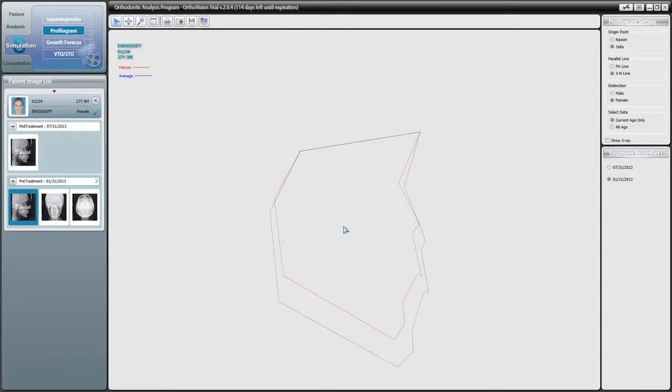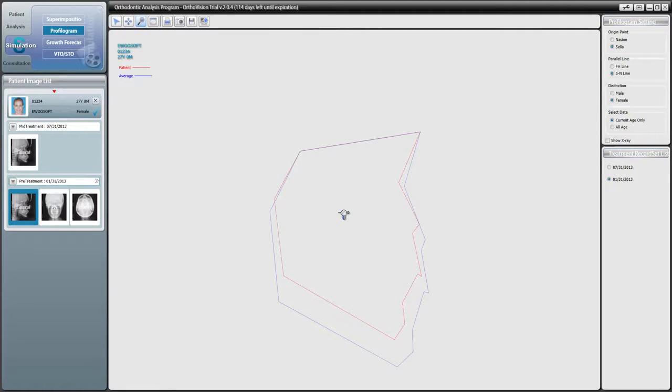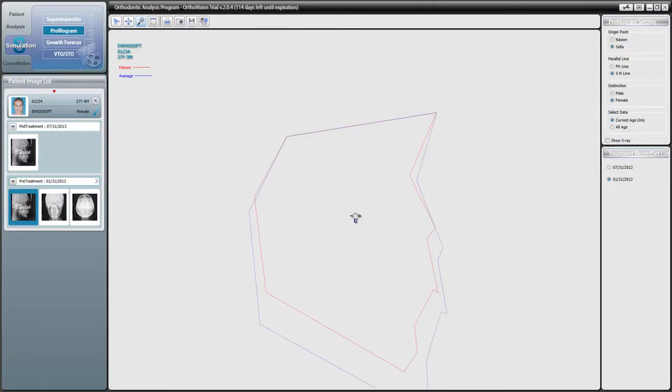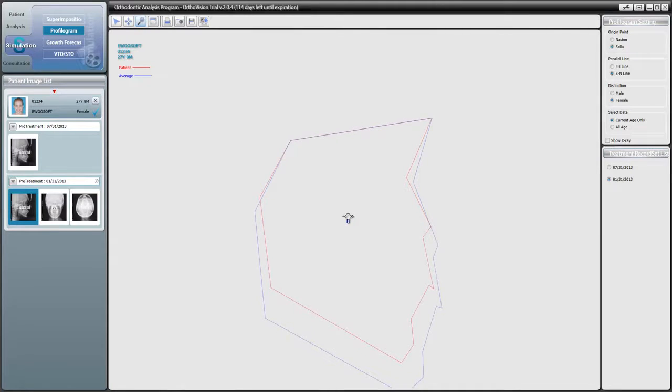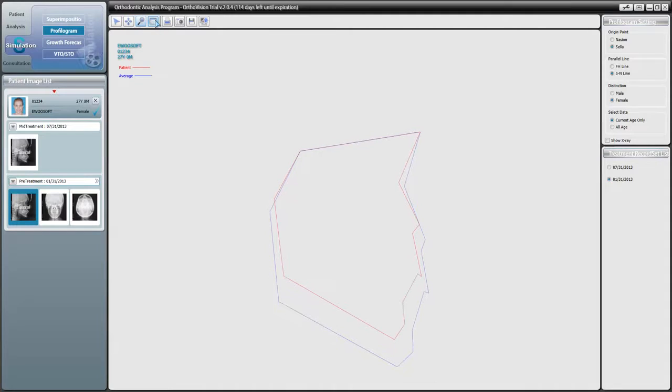Finally, across the top, we have our camera tools and exporting tools. The first camera tool is a panning tool, which when selected, you can simply click and drag your image. The second tool is the zoom tool, which when you left-click and drag your mouse to the right, it zooms in, and when you move your mouse to the left, it zooms out. The third tool is a fit image tool, which fits the image to your screen size.